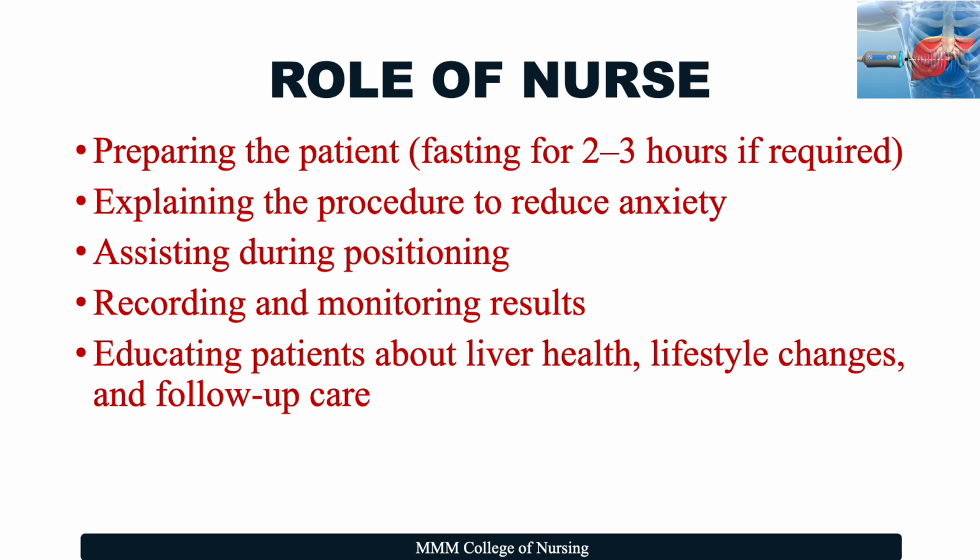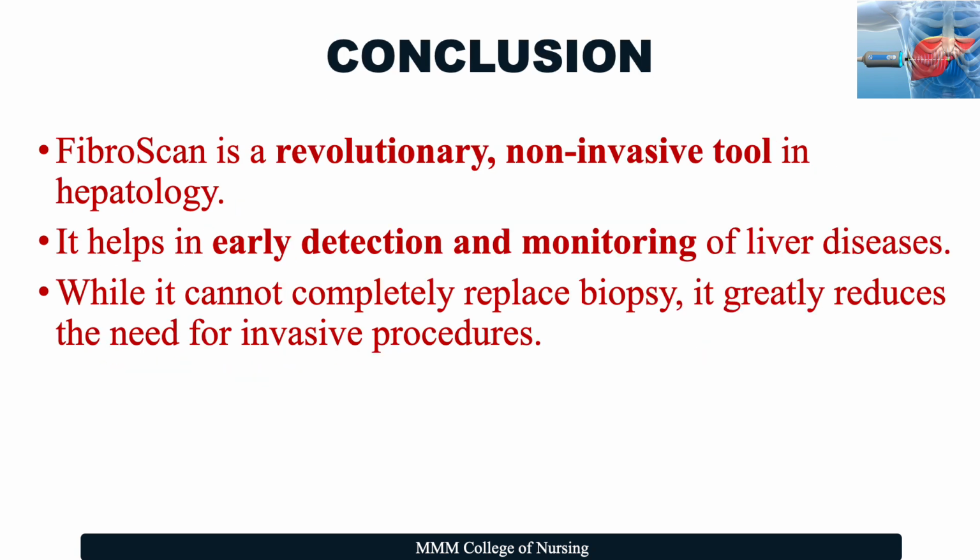The nurse plays a role in preparing the patient. That is, the patient has to fast for 2 to 3 hours if required, explain the procedure to reduce anxiety, assist during positioning, recording and monitoring the results, educate the patients about liver health, the lifestyle changes that need to be made, and follow-up care.